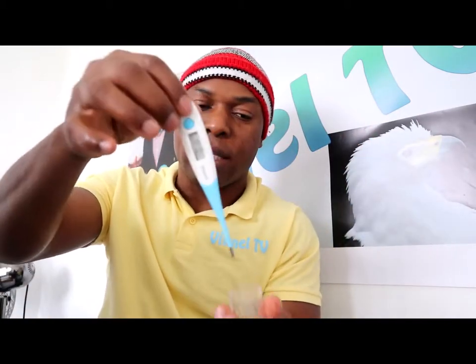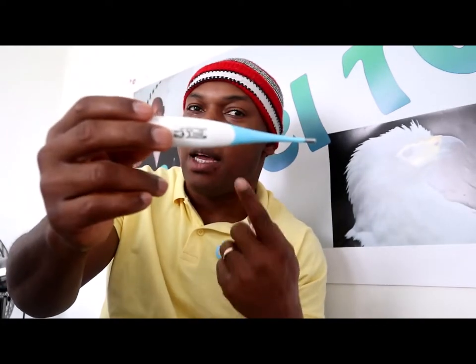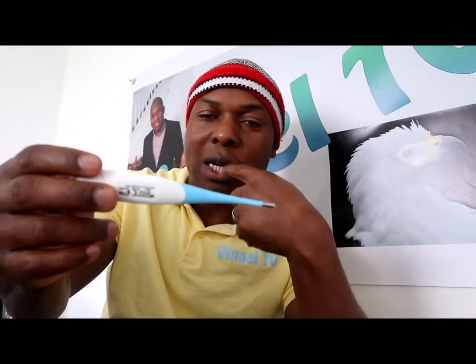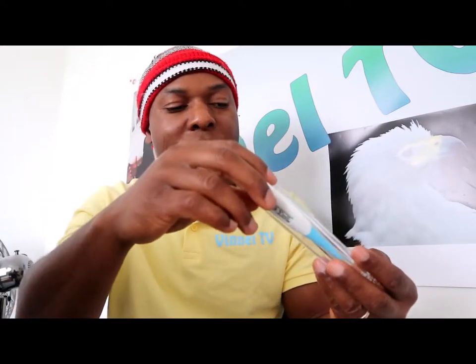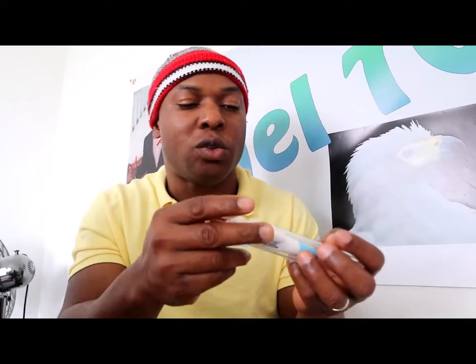Okay, so guys, this equipment, this gadget is very good to have at home. You can hear the sound. If you take it out and turn it on without measuring, it will just show you a low reading. But put it underneath your tongue and press, you get the reading. After a few seconds, the reading will show. Okay guys, I just thought to show you how to use a thermometer probe. This is what every family needs to have, especially if you've got kids, to make sure that the body temperature is within the normal range and it's not too high or too cold.